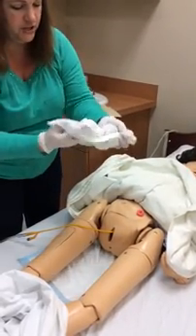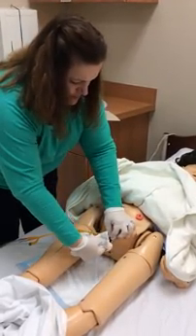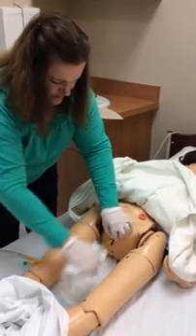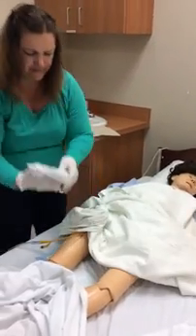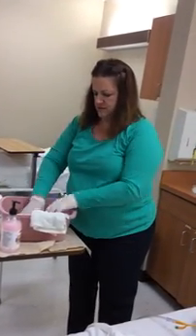And now, making sure you're changing the spot on your washcloth, I'm going to do the catheter. So I'm going to squiggle it just a little bit. Make sure you hold it in place. You're going to clean down the shaft of the catheter. Set that on my side. Don't ever leave your washcloth in the water.